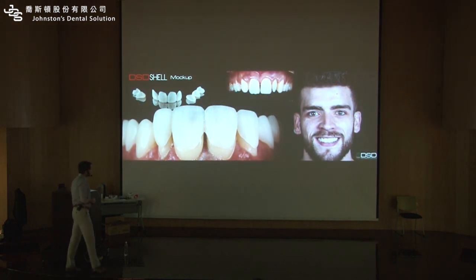Now, another thing that is getting interesting is that these printed materials are now approved to be used in the mouth. So if you have a printing machine, and that's why I recommend every dentist to buy a printing machine, you can start printing your own provisionals. Imagine that. Chairside. We design quickly everything. You print. The cost is super low. And you have inlays, onlays, veneers, crowns, anything you can print. Even prosthesis over implant. You can do a lot of cool stuff with printing.